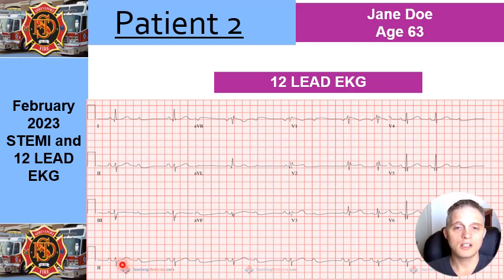But what is different about this? And this is a repeat of ACLS. We look at our P waves, the very next one, we have upright P waves, but then we have missed QRS complexes. And we have to determine, do we have elongation? Do we have just a random beat drop? Do we have discontinuity between the QRS and the P waves? And that's what it looks like. It looks like a 3rd degree heart block.